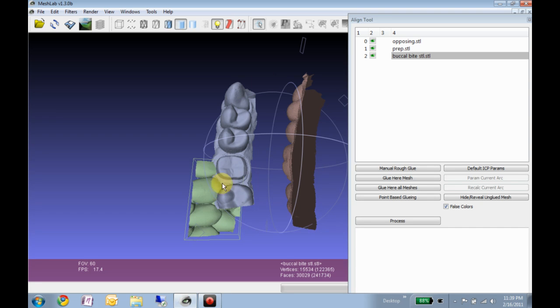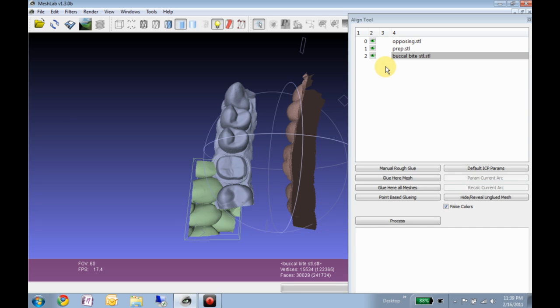The first thing, it always helps to get the models roughly in place, and the way you would do that with multiple images is you assume that you take images kind of in sequence with some overlap, so they're already roughly together, and the computer can just grind through.